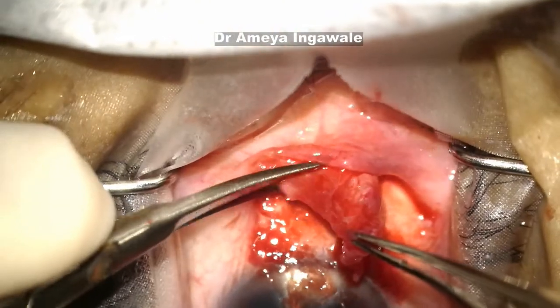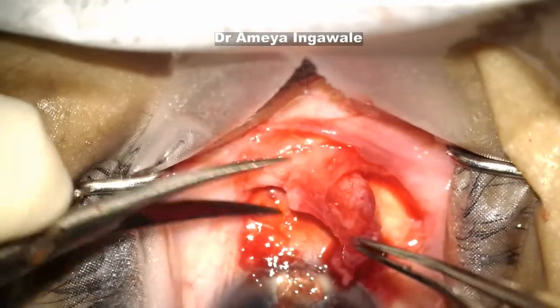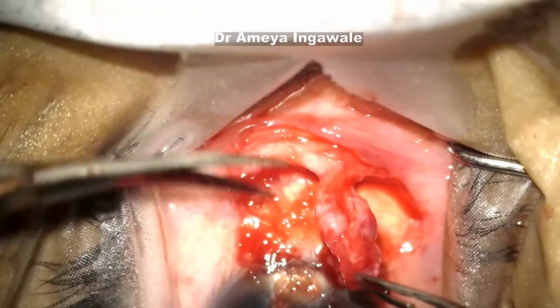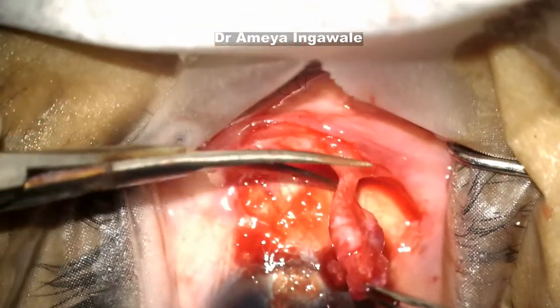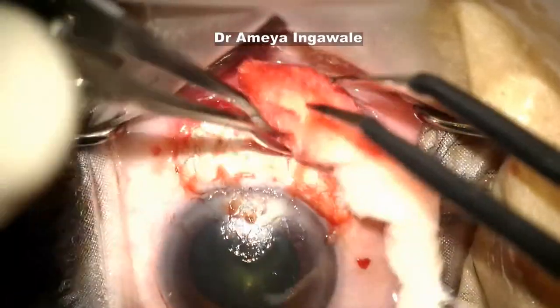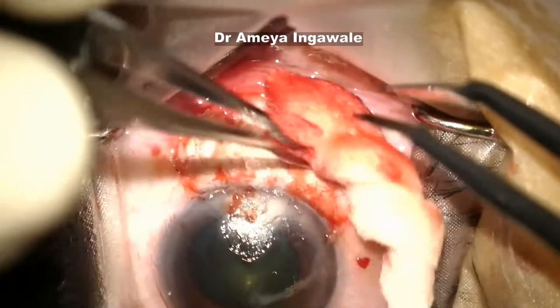Now you can start from the other side, again in the white part. Don't leave any of the pterygium tissue behind. The entire tissue including the lateral margins — the wings on both sides — has been removed.